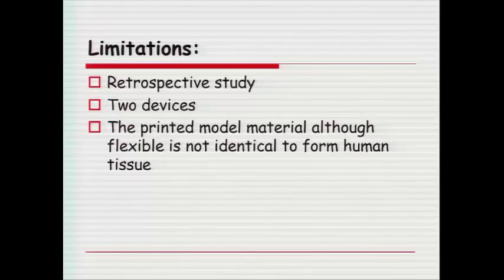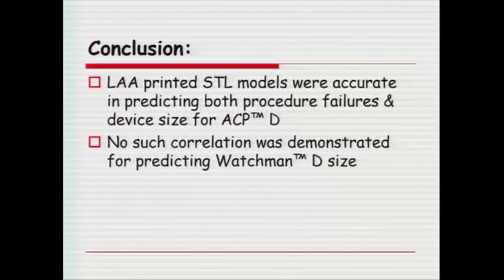The study has several limitations. It was a retrospective study, and it looked at 2 different devices. And the printed model, although we used flexible material, of course, is not similar to human tissue, and this is going to be an inherent problem whenever we look at 3D printing.